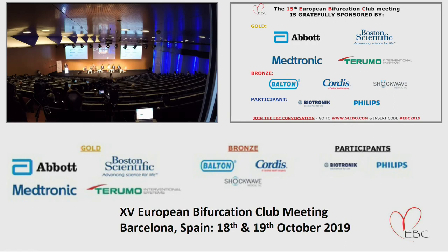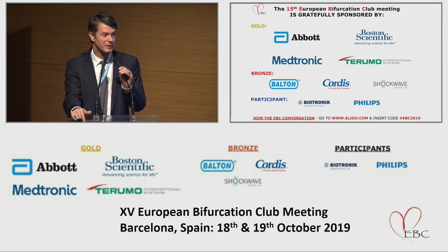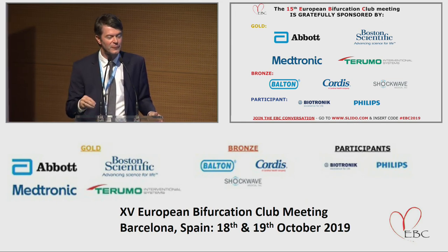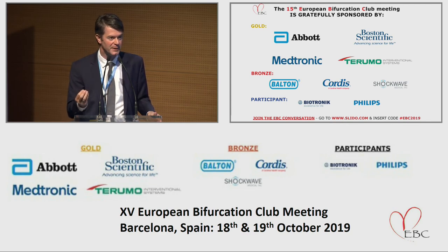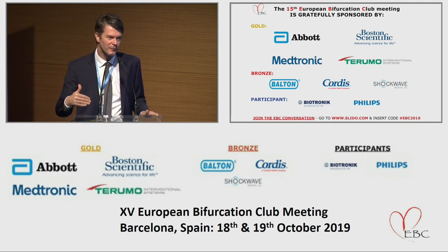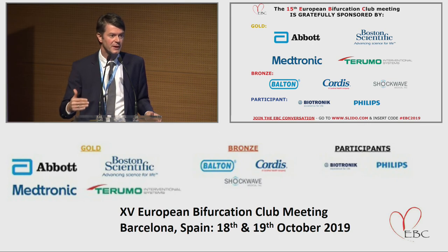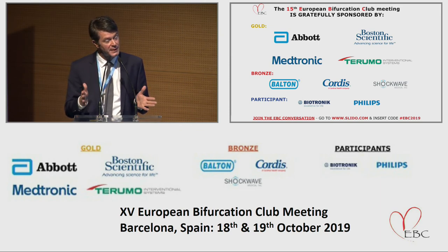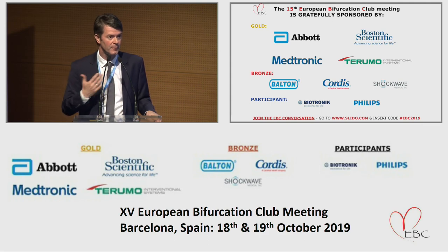Mm-hmm. We also participated in the first-in-man study with the drug-coated AngioSculpt, by the way. And honestly speaking, I think it's not the best approach. I think we should invest time and tools in the best possible lesion preparation, and then decide whether we need the stent or we use the DCB. Here we mix the two concepts. We should do this with a final size balloon, in my opinion, at least a balloon to vessel ratio of 0.8 to 1.0. If our approach is first with a final size DCB or drug-coated scoring balloon, this will not work, because we will create a lot of situations where we need additional stenting afterwards, in my opinion.